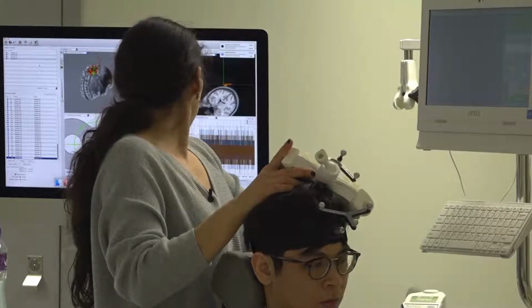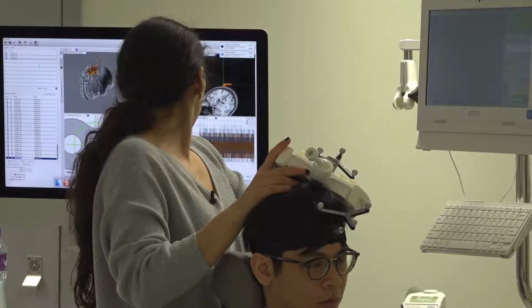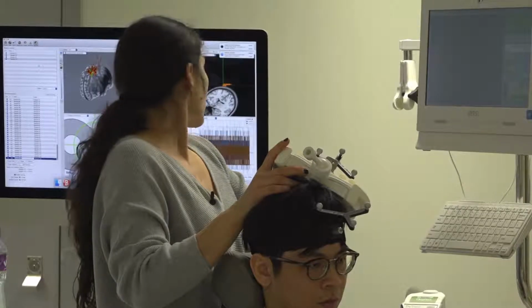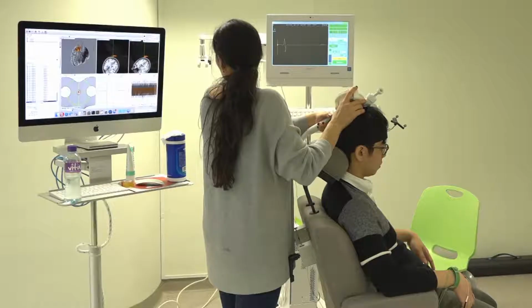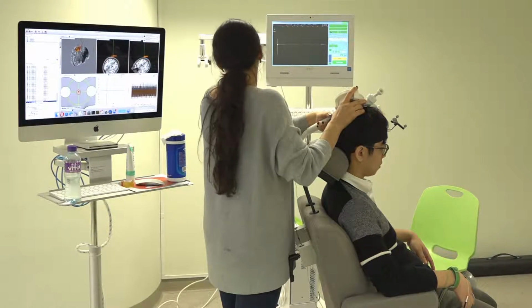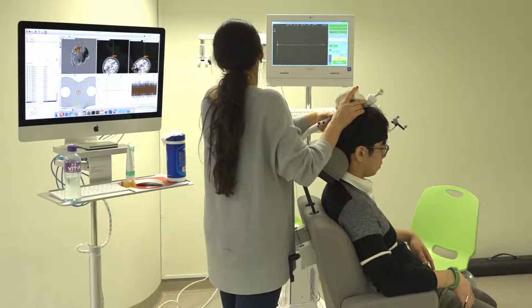Let's see. I should be able to get better points here.